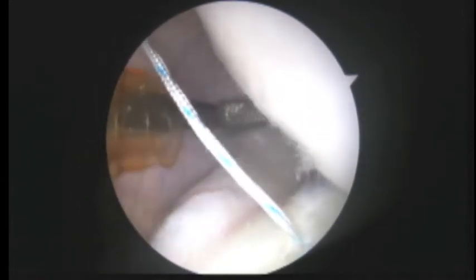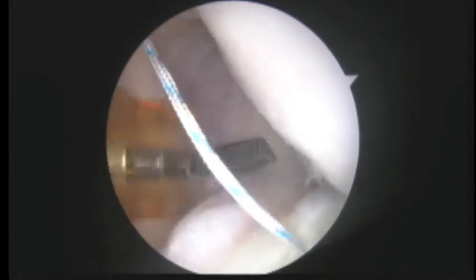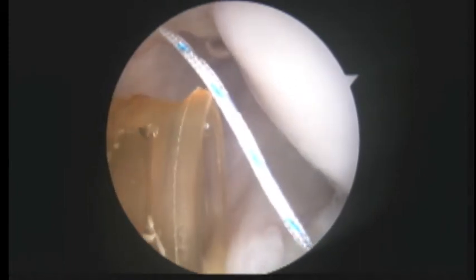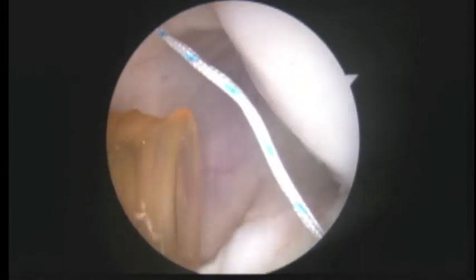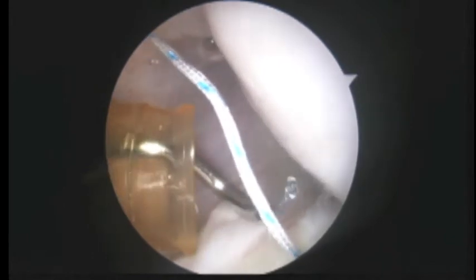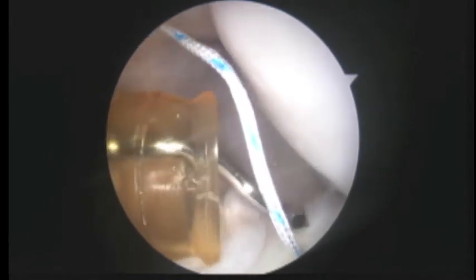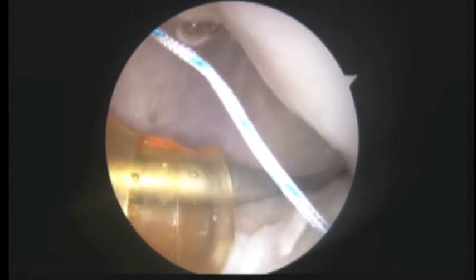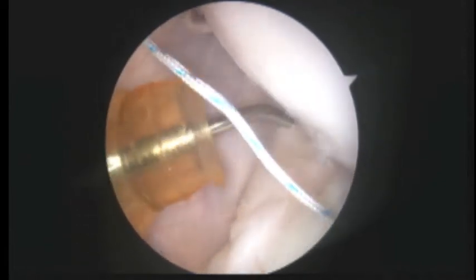Okay, so we'll go ahead and take the next instrument, which is a suture hook. And this instrument is hollow on the inside. It's loaded with a black wire that we call a super shuttle. Here's the hook. That black wire is the super shuttle. And so we start here. We're going to go down into the capsule like that.